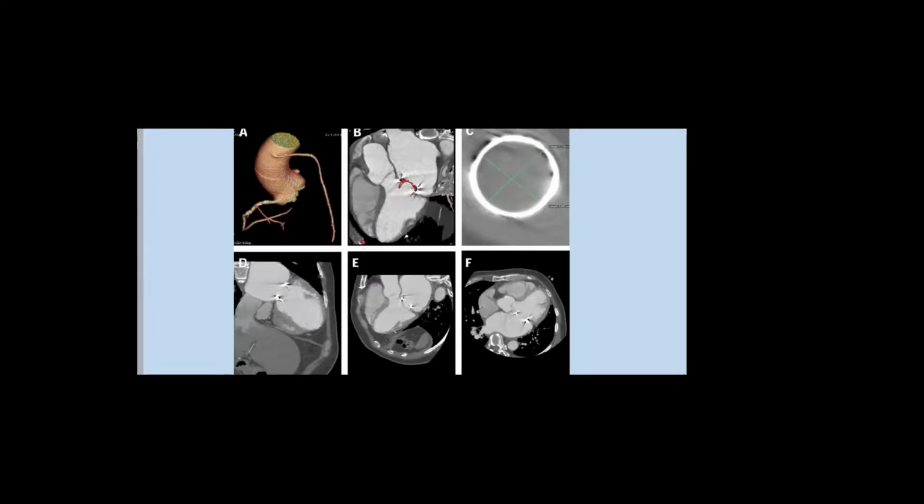Is it going to cause obstruction, and will that obstruction be severe or not? So again, cardiac CT gives data about valve-in-valve implantation.